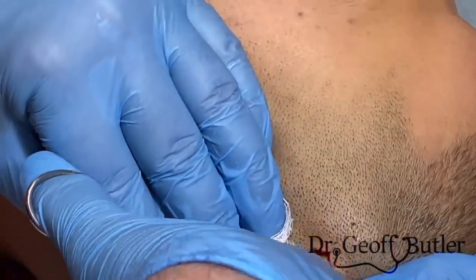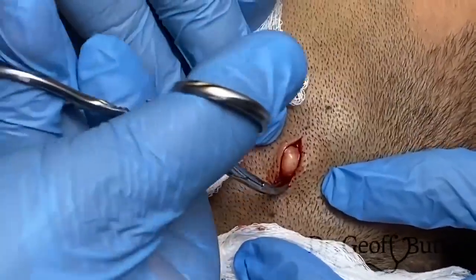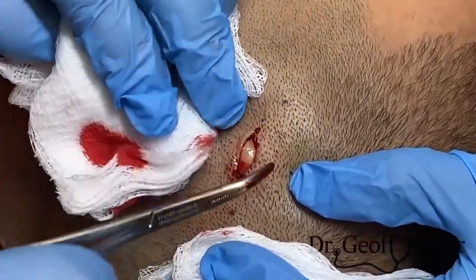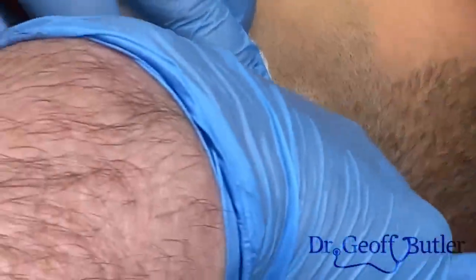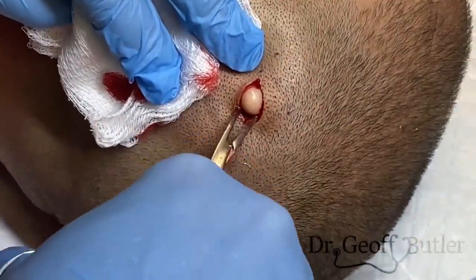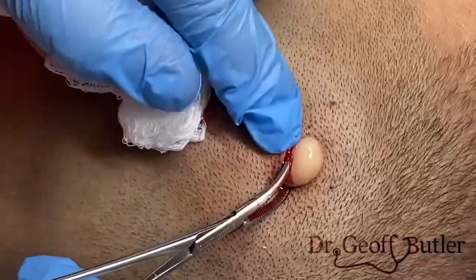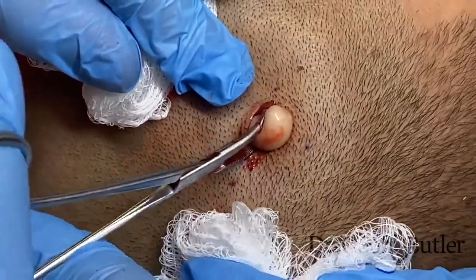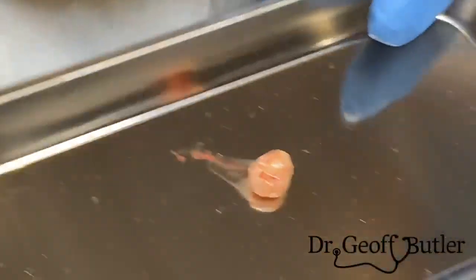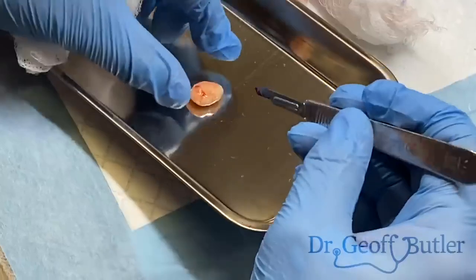If I start to rotate this just a little bit, I'm going to do it from the back end as well. And see that just came off of it? See that membrane that's right there? Yeah, that's what was holding it in place. Let's come out. Pop it down there. So this is certainly just consistent with a pilar cyst, which is what we had thought would be most likely.